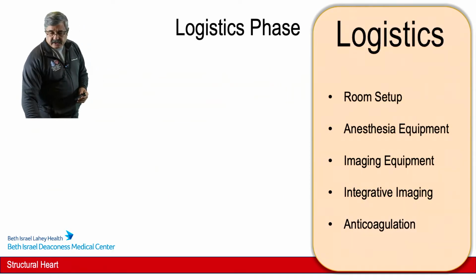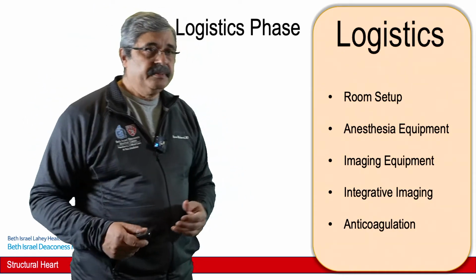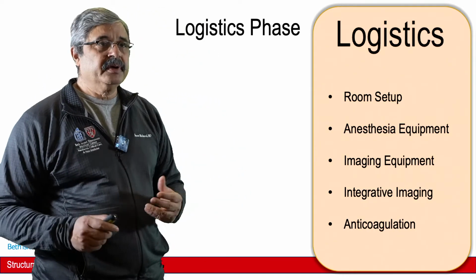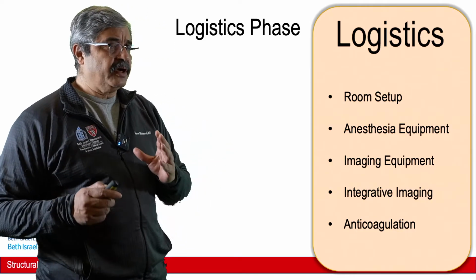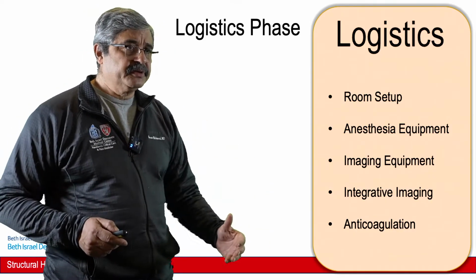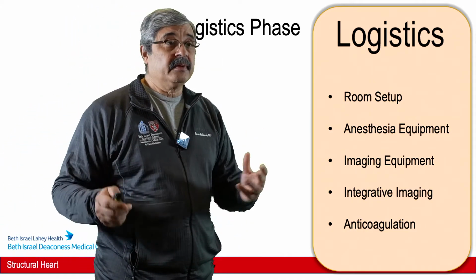So first is the logistics phase of the procedure, which consists of room setup, anesthesia equipment, imaging equipment, integrative imaging, and anticoagulation. And these are important aspects. We've had procedures in which, right in the middle of the procedure, when we started 3D imaging, we found that the 3D probe was not working. That added about a couple of hours to the procedure.